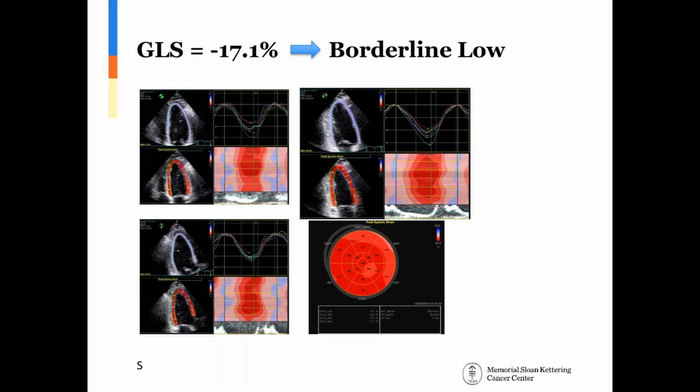There's a problem with image quality and strain, but even a bigger problem is seeing people from the outside, where decisions are made or patients are sent because of abnormal strain that is totally worthless. So it's not only what we're doing, the community and the affiliates around that are reporting strain based on really poor image quality.